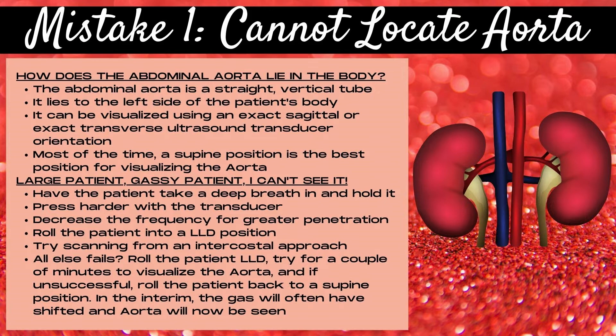What happens when you get a large patient or a gassy patient and you just can't see the aorta? First of all, have the patient take a deep breath in and hold it. This is going to help you visualize especially the deeper portions of the aorta, such as the proximal aorta. Next, you want to press harder with your transducer. When you're first learning ultrasound, one of the easiest things to do to improve your images is simply press harder.